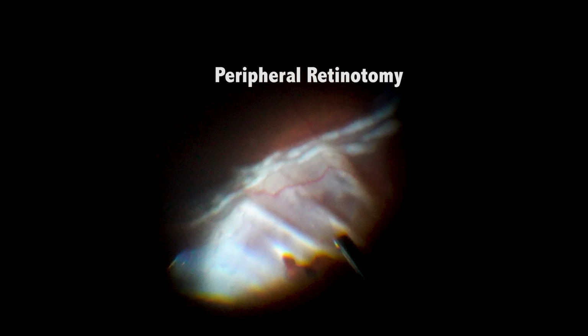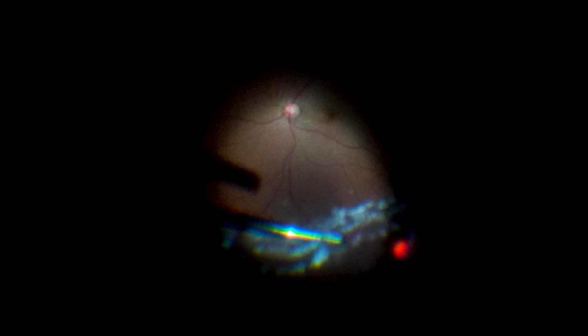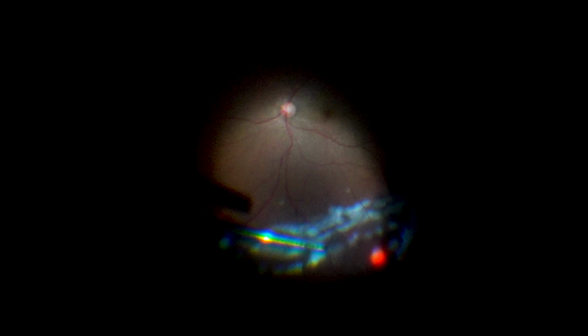Enough laser was made as to prepare the area for a relief retinotomy. Peripheral retinotomy was then completed. The retina was pretty flat, even though a bit retracted peripherally. There were no retinal folds whatsoever. Some more laser rows were made with adequate spacing. All the superior and temporal periphery were covered by laser.